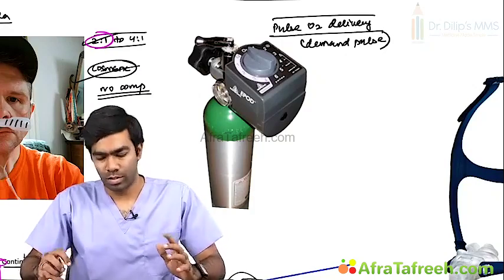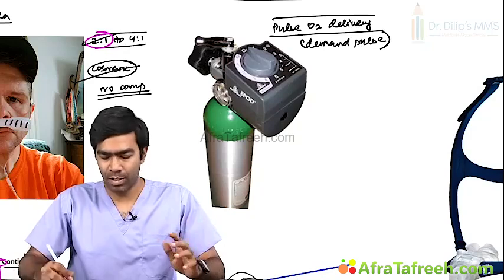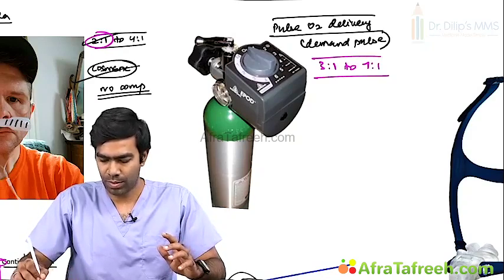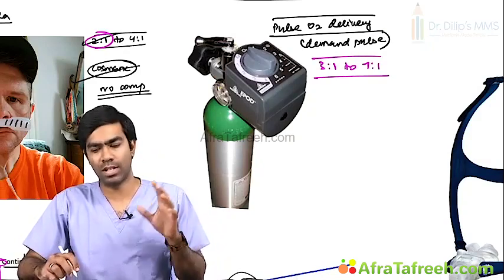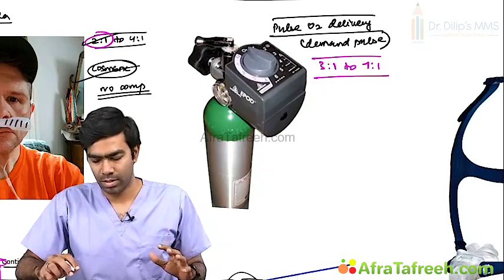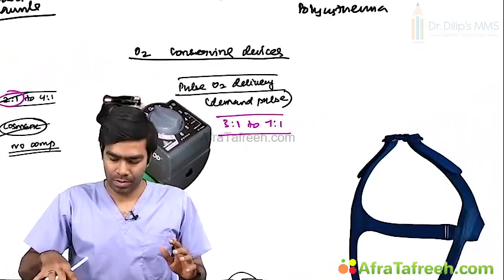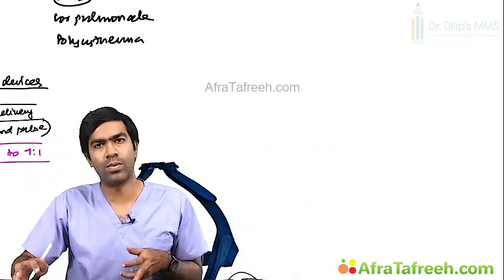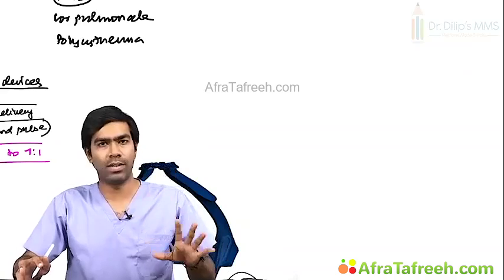So how does this work? Here they are going to conserve oxygen extremely well. The conserving efficiency will be 3:1 to 7:1. But remember the physiology behind how these conserving devices work. When the pulse is delivered is the key.